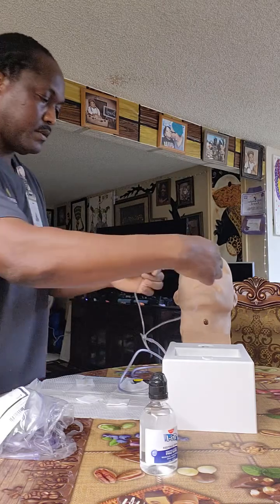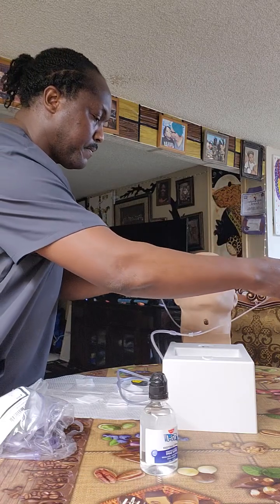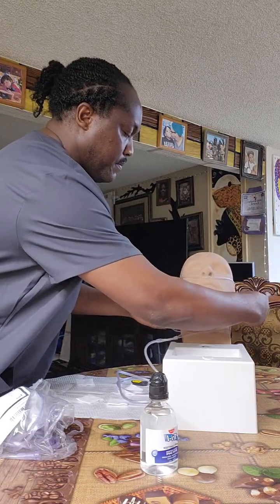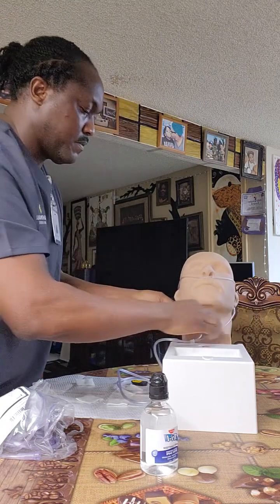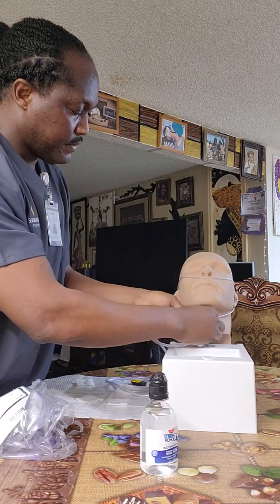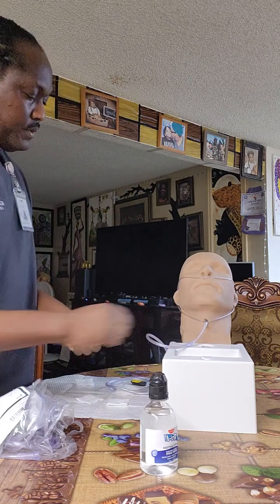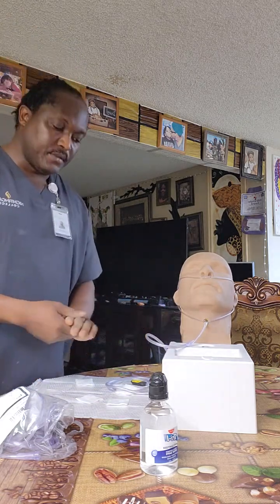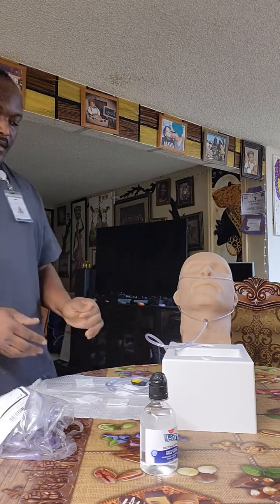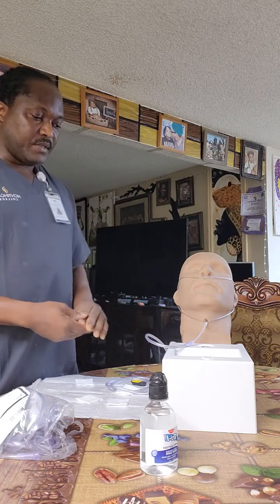in my patient's nose and around his ears. Then I'll strap it, not too tight, to give some comfort to the patient. So the flow rate that the doctor gave us was 4 liters per minute. Usually if it is more than 4 liters, like 6 and above, then the patient will need a humidifier. So right now, some hours have passed.